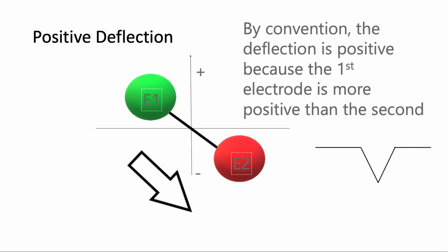That's what throws people off, because you might more intuitively assume that a positive deflection goes upward. However, it actually goes downward. So there are two ways I've found that are most helpful to remember this. The first is a system I developed myself to help me visually remember better what was going on.